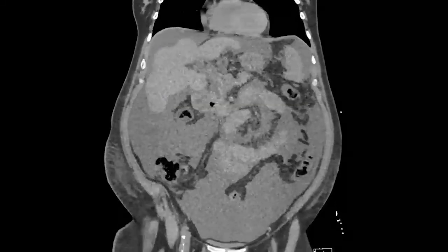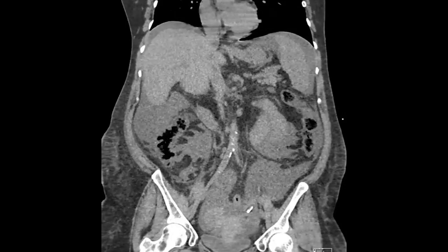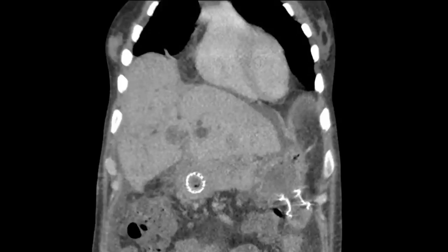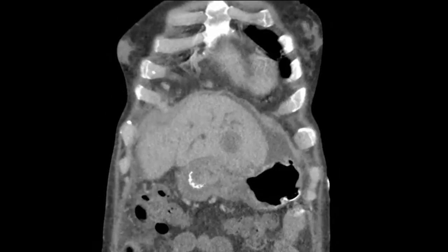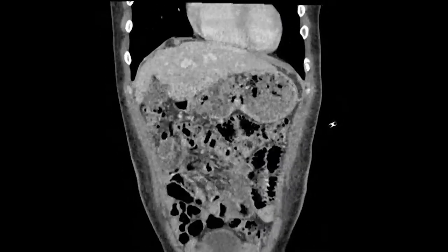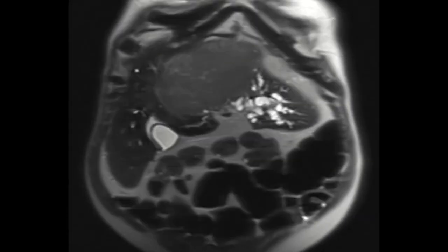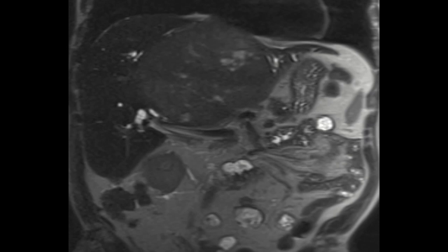Unfavorable factors that may increase the risk of complications are large volume ascites, as is seen here. Liver tumors that are located in segment 2 or 3 that fall within or close to the EUS-HGS tract should be avoided. Patients with portal hypertension tend to have extensive collateral vessels around the stomach, and the risk of bleeding with transmural access is high.